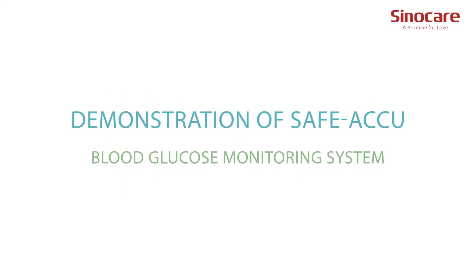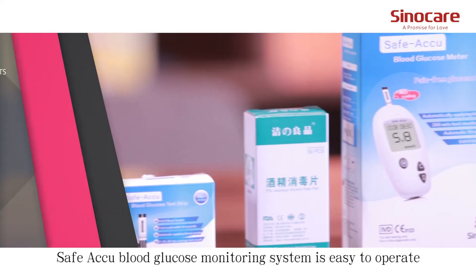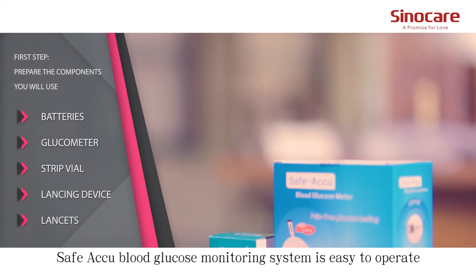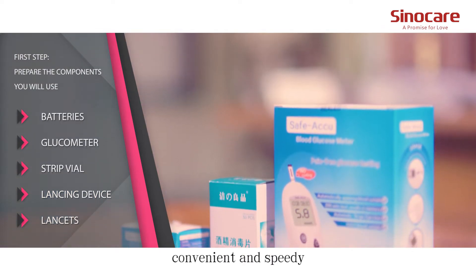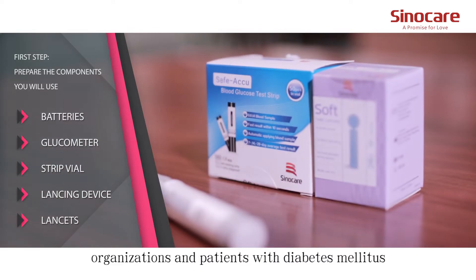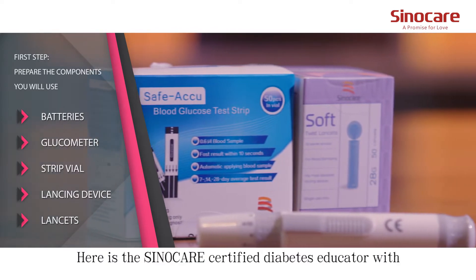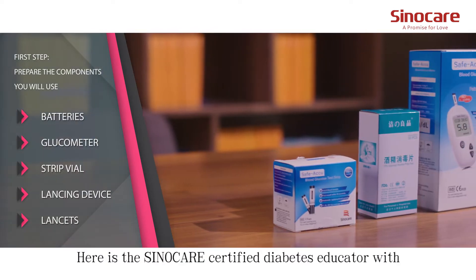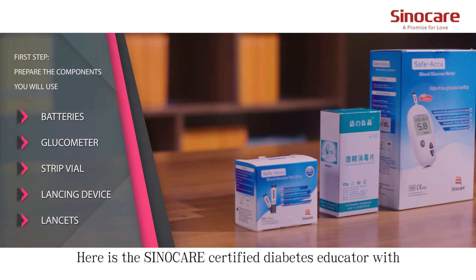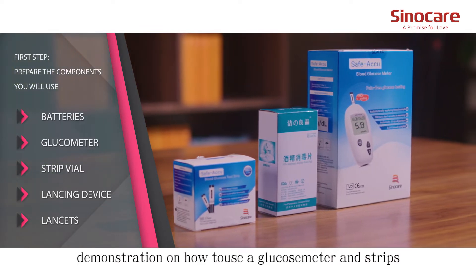Demonstration of the Safe-Accu Blood Glucose Monitoring System. The Safe-Accu Blood Glucose Monitoring System is easy to operate, convenient and speedy. It can be applied to medical organizations and patients with diabetes monitors. Here is the SinoCare Certified Diabetes Educator with a demonstration on how to use a glucose meter and strips.